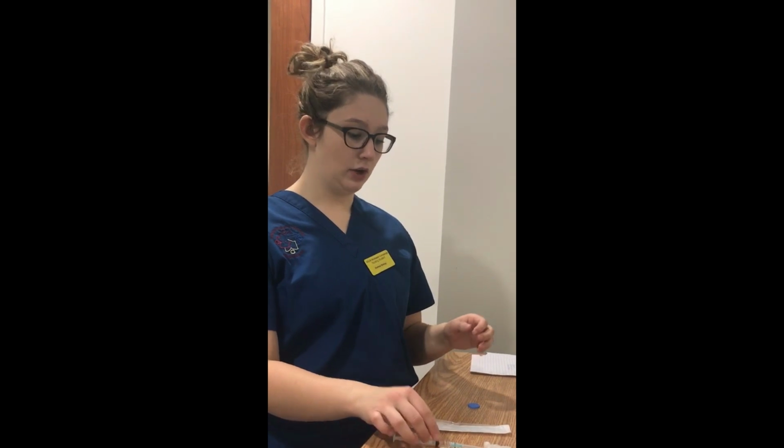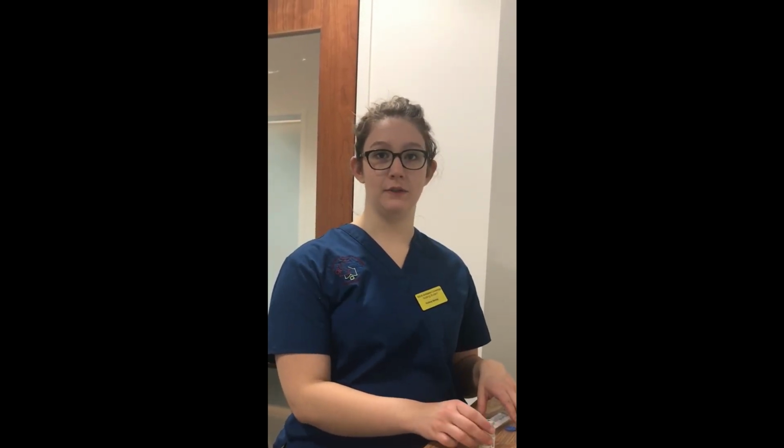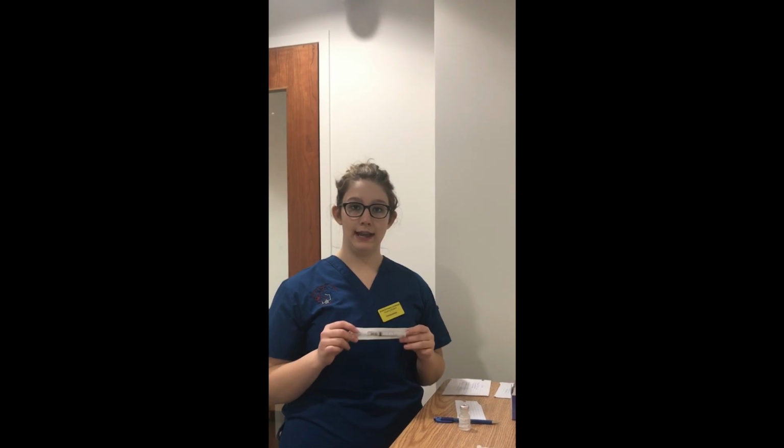So now that I'm done drawing up my medication, I'm going to throw out the top of the vial, and I'm going to throw out the syringe wrapper, and then I will put the heparin back into the proper storage facility. So now I will begin to assemble the medication for the IM injection.